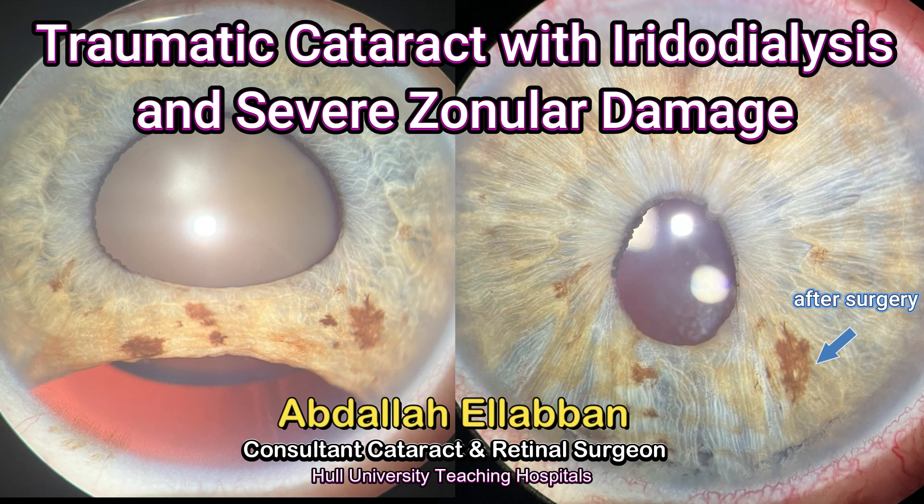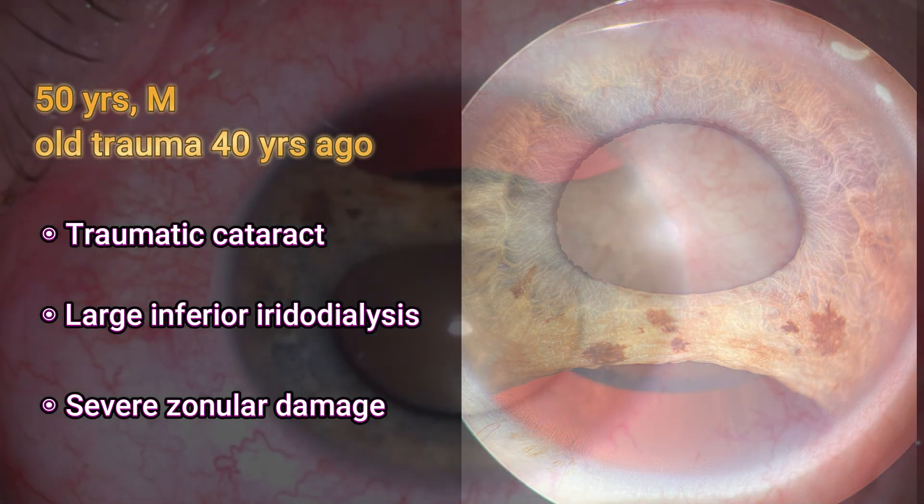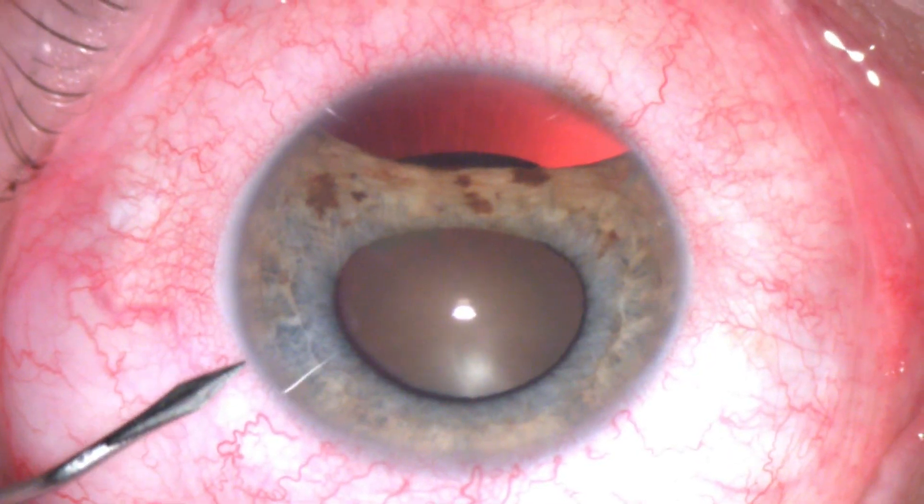Hello everyone. This is a case of traumatic cataract with severe iridodialysis. It was a previous old trauma 40 years ago. There are three main problems here: the traumatic cataract, the large inferior iridodialysis, and the area of zonular damage.